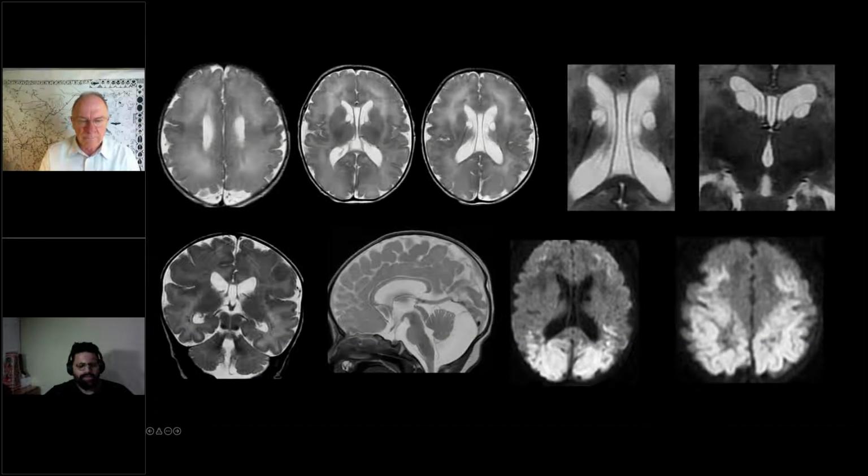Moving on to the MR images. I think one of the fellows can take it. Dashrath, do you want to take it? Okay. Okay, I'll go ahead.